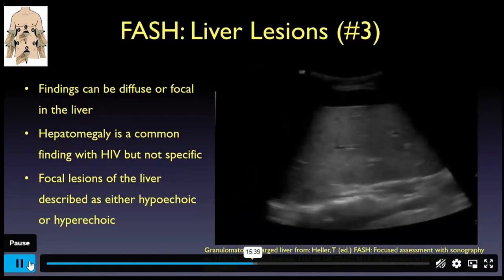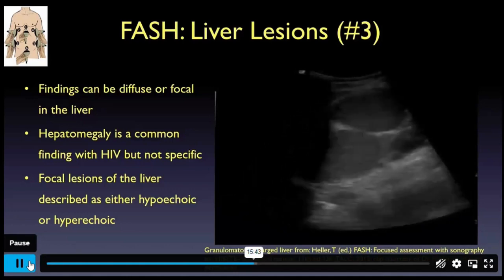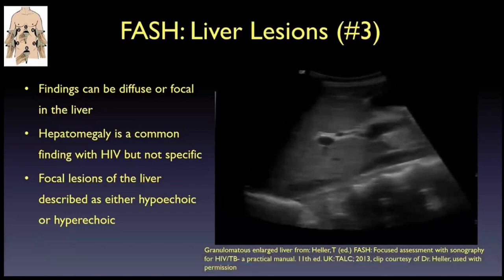And then just to note, you can also see or comment on hepatomegaly. However, this is not specific at all for TB, as HIV positive patients often have hepatomegaly.